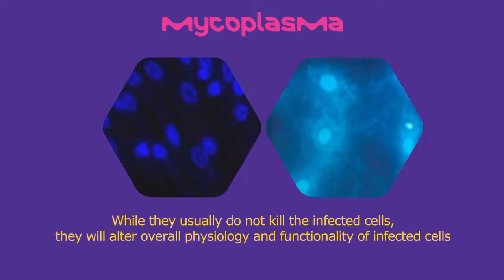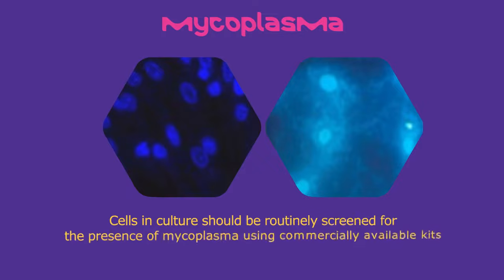While they usually do not kill the infected cells, they will alter the overall physiology and functionality of infected cells. If you notice your cells are not behaving in an expected manner, such as slower growth or change in morphology, it would be a good idea to test for the presence of mycoplasma through commercially available kits.